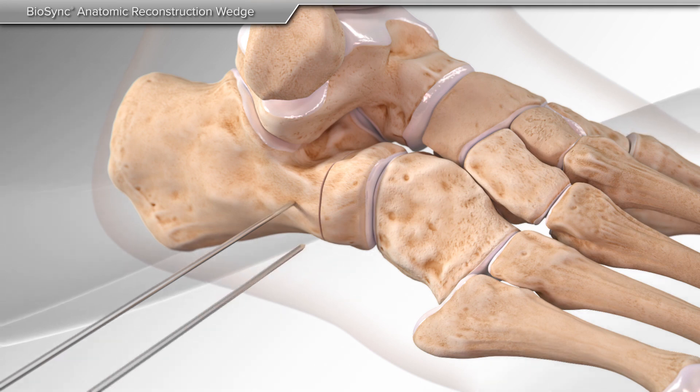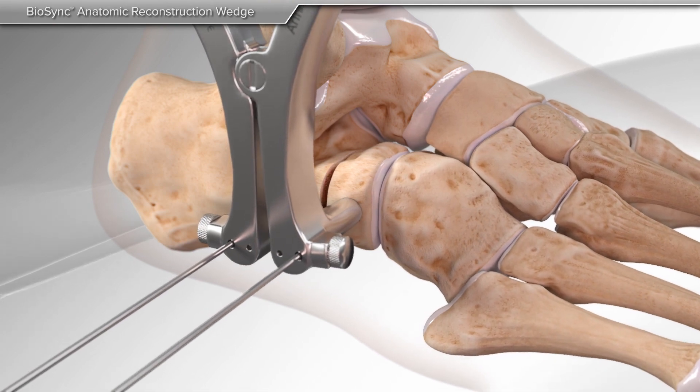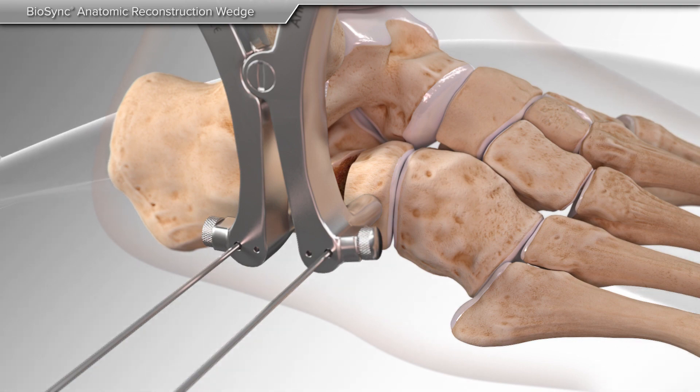A pin is placed on both sides of the cut bone, and a special instrument, or distractor, is placed over the pins to allow for opening of the bone in a controlled manner. The distractor is opened until your surgeon achieves the desired correction.